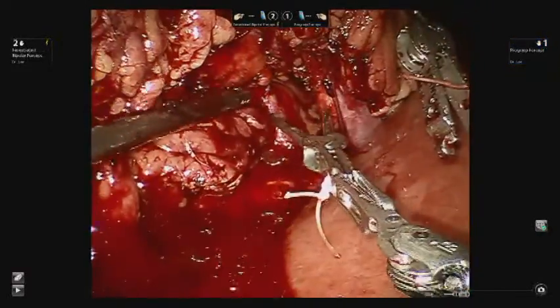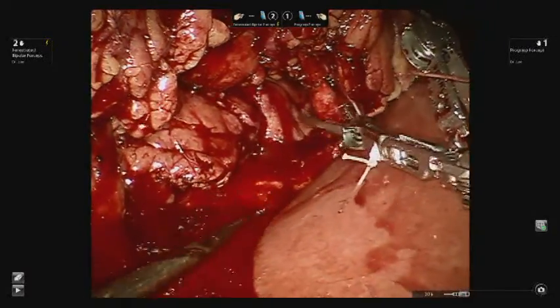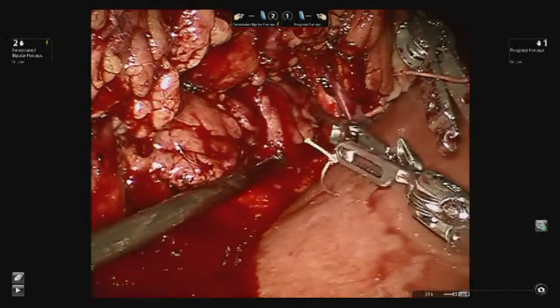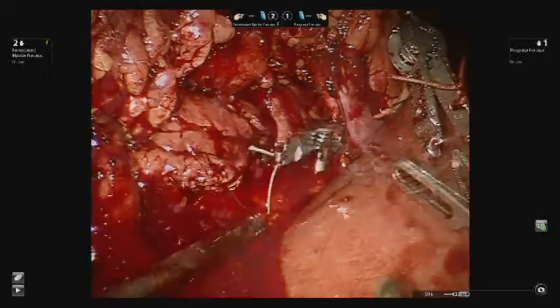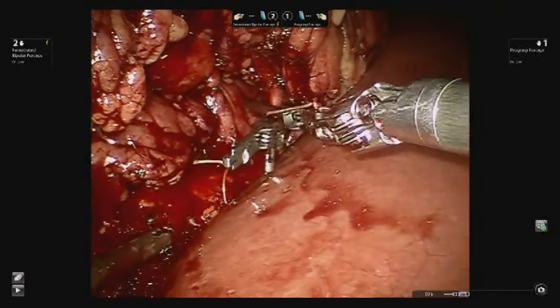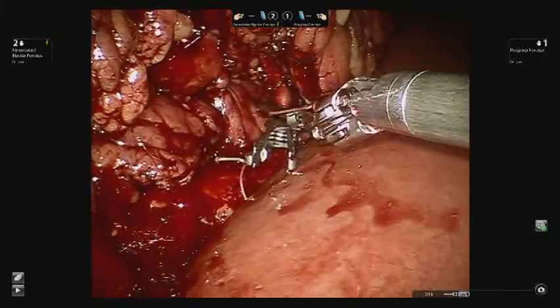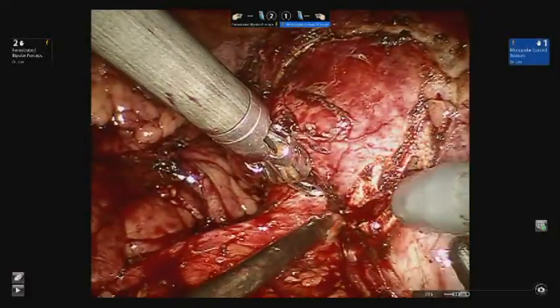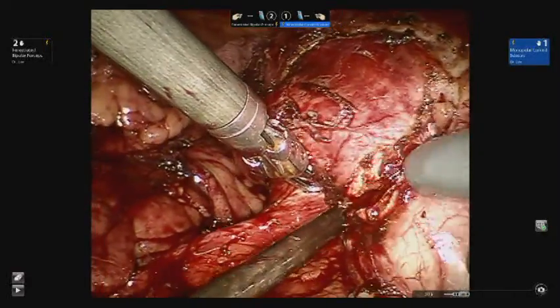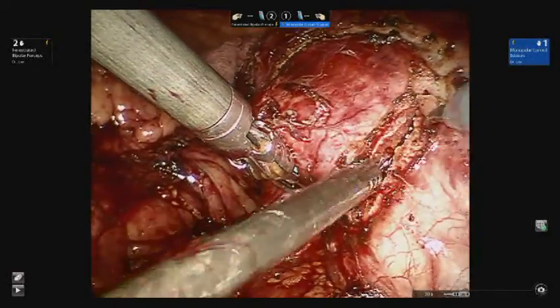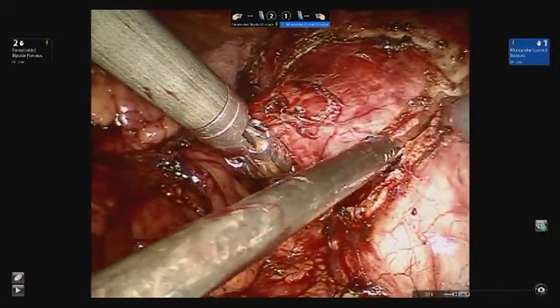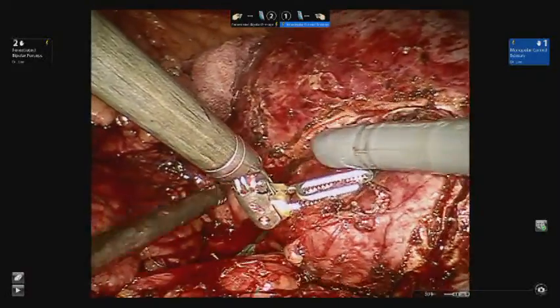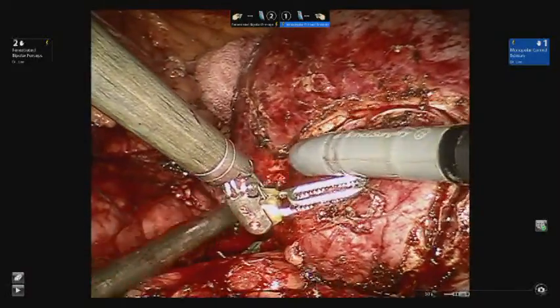Once the margins are scored, two bulldog clamps are placed on the renal artery. In our experience, we leave the renal vein open and unclamped throughout the procedure, even with the hilar location of the tumor. The tumor is then resected using cold scissors circumferentially, with the assistant using suction to provide counter-traction and keep the resection bed bloodless.